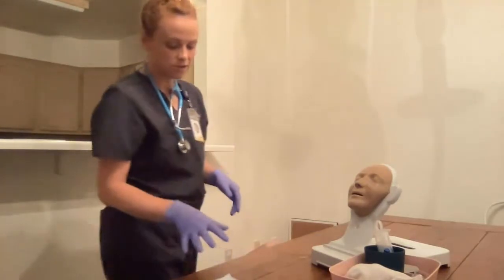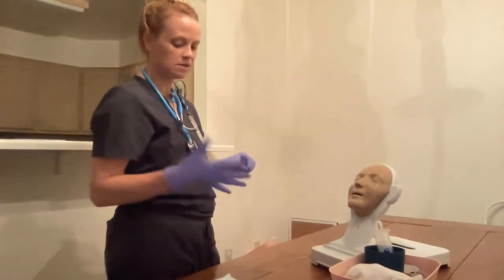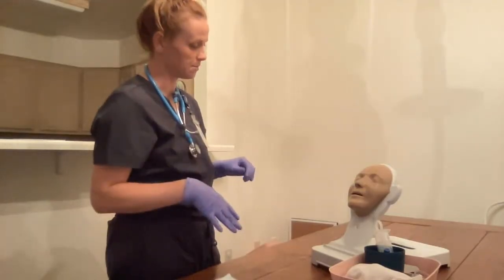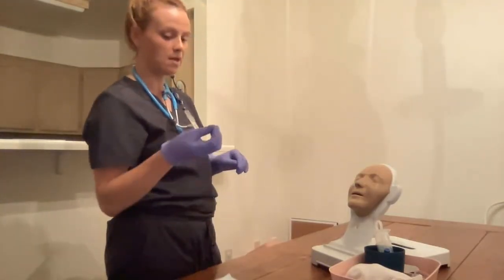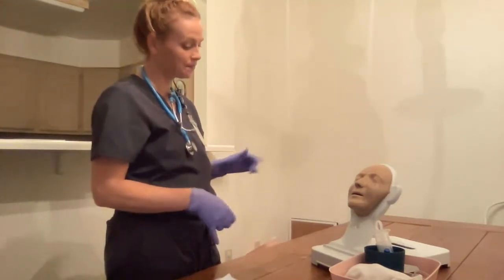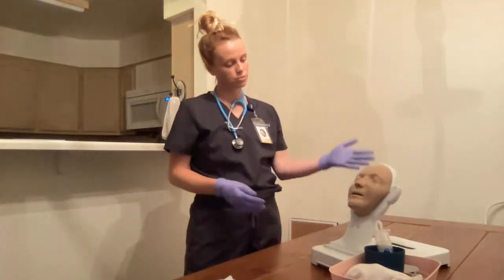It is just for, due to your Parkinson's complications you've been having, it's for feeding or medication administration, anything like that, just to help it get to your stomach a little bit easier for you. It is a tube that goes in your nose and travels all the way down to your stomach, okay? To start off, I'm going to place you in high Fowler's position.